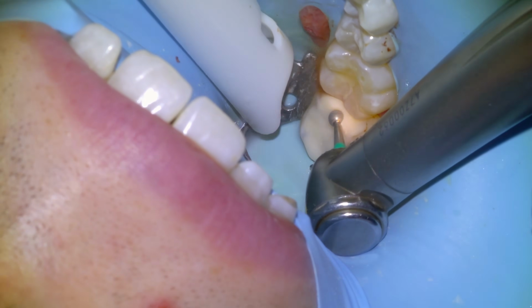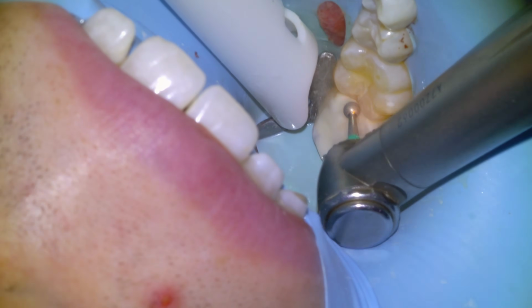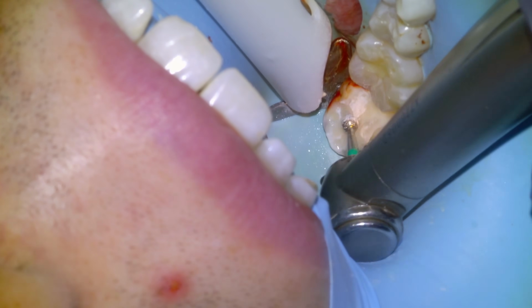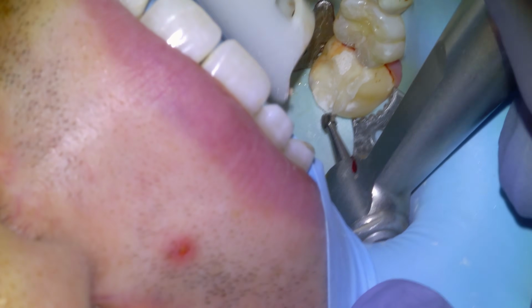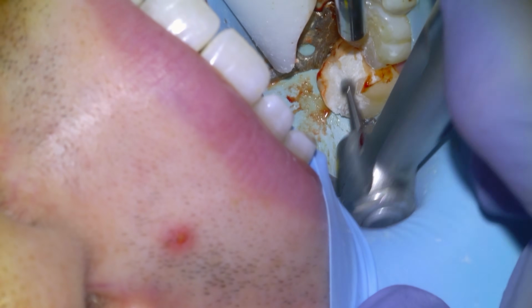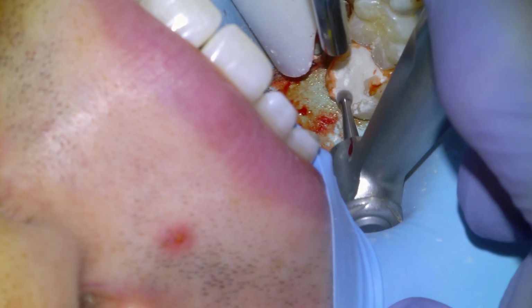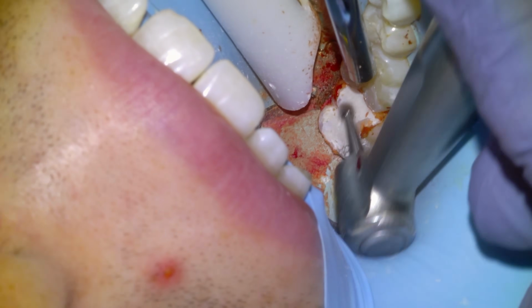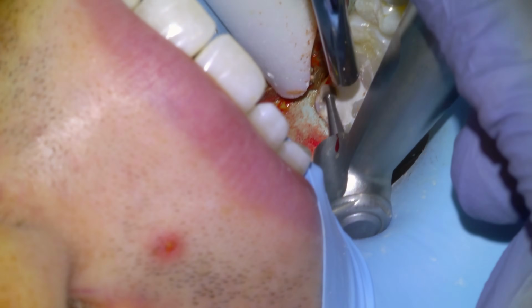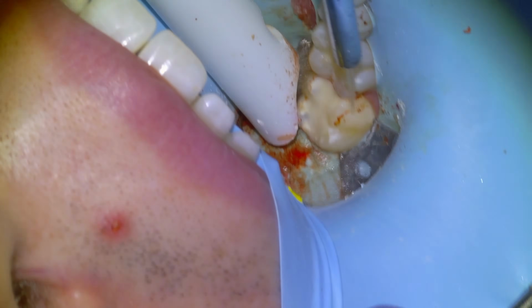So we're going to begin removing the excess restorative material with a large round diamond. And then doing the finishing of the excess material with a large round carbide on a slow speed. And I love finishing glass-based restorations because you can so clearly see the margins.